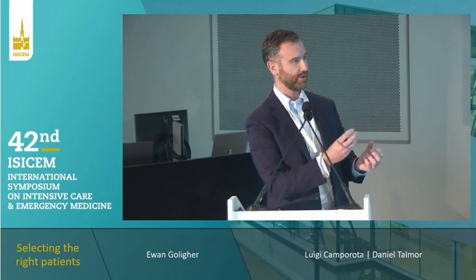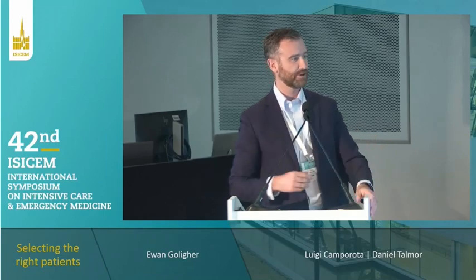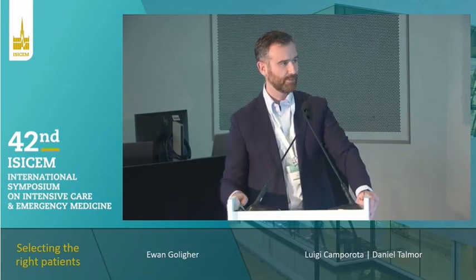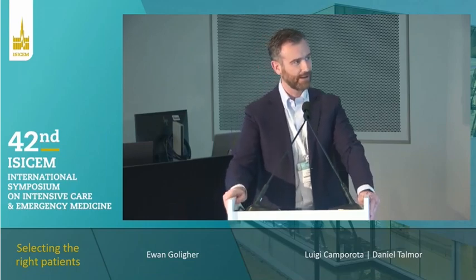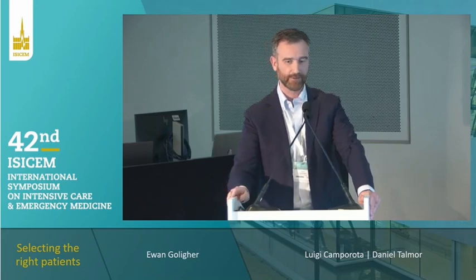The original paradigm stipulates this interaction between how much CO2 you can remove and how much dead space there is. So probably if you have a more efficient or physiologically effective system, that balance might be a bit lower. And so we need to think carefully about the design of the next trial. The ultimate trial will be an opportunity to see if that kind of subgroup effect persists. As for the surprising influence of hypoxemia, I think that needs to be replicated because it's certainly not exactly what we predicted either.